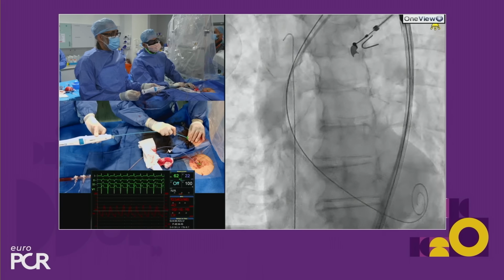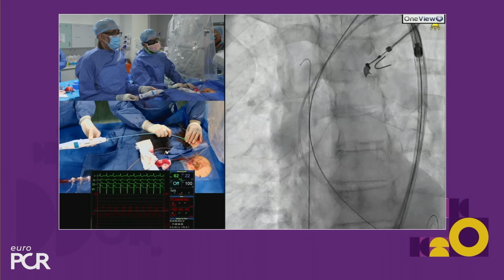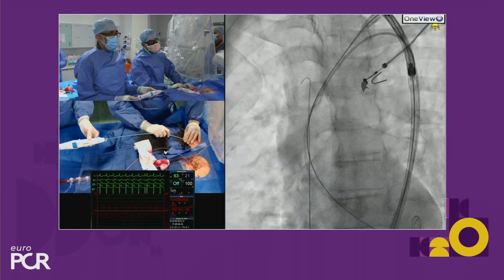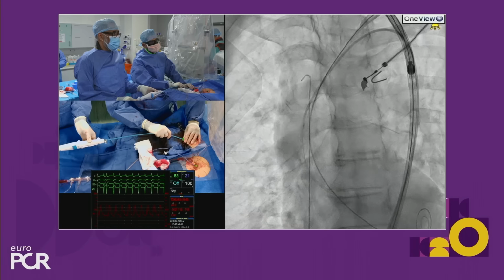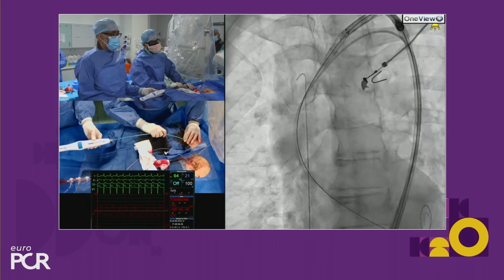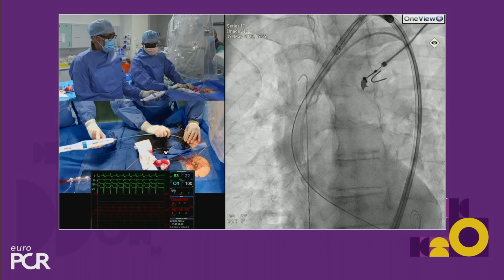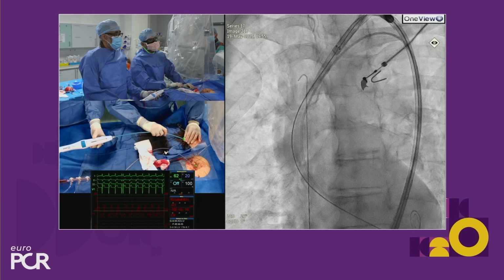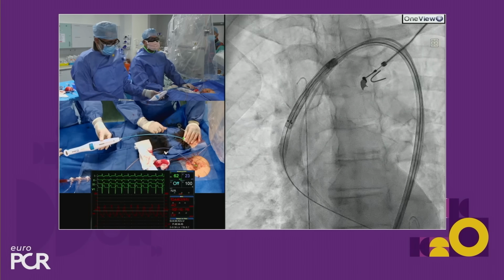Go up a bit. Can you see? Hang on. Go up a bit. Go up a bit. Are you on mag? Or are you off mag? Okay, so you can see that it's quite tight there. The arch, it's just about to go. That's it. Okay, so save that. Hold it. Save that. So there was some negative pressure on the wire, some gentle forward traction, a nicely sedated patient. Okay, so let's go to the implant, grab that implant view.